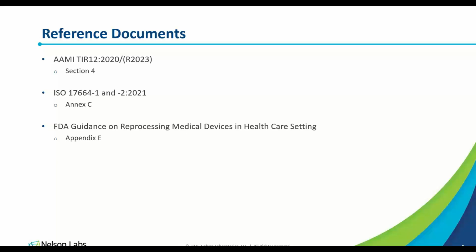And so really, at that point, you can also just take a look at, are some of the features necessary? And if they are, then obviously leave those on the device. If they're not, then maybe figure out a way to limit some of those challenging features that are on the device. Or kind of going back to the previous question, assessing whether you should make the device be able to be disassembled.